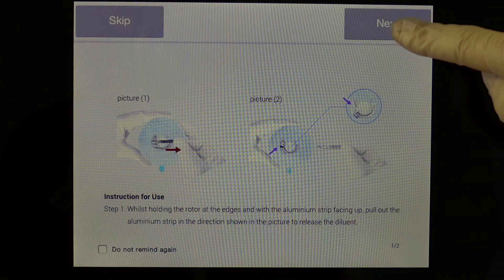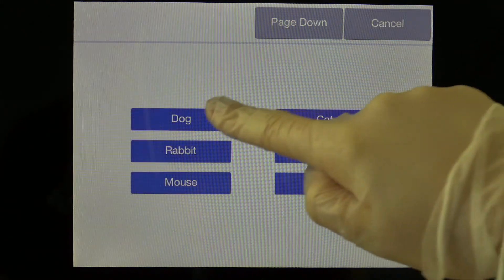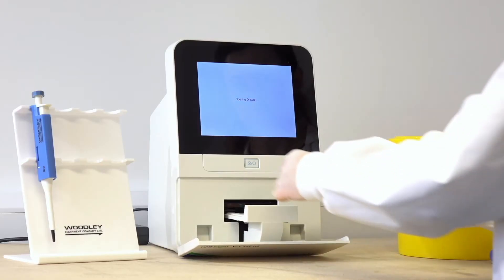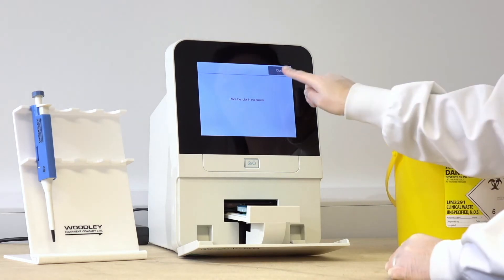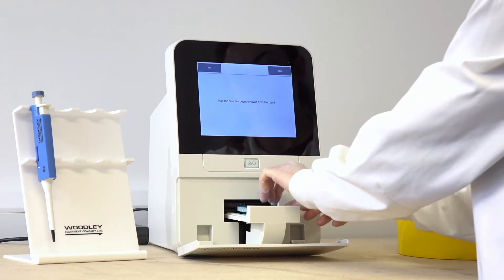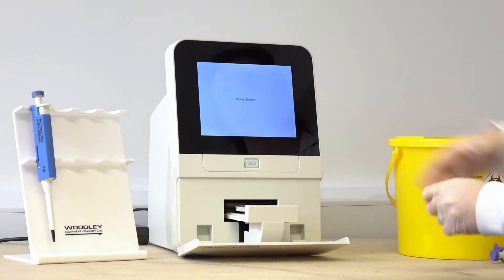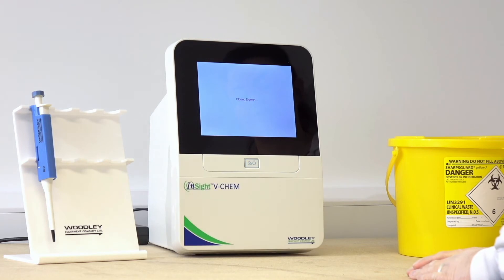The analyser shows on-screen step-by-step instructions on how to prepare the rotor for testing. Select the species to be tested on the analyser screen. Once the drawer has opened, place the rotor on the drawer securely and press Close. Ensure the blue film has been removed from the rotor. Analysis will now begin. Analysis time for whole blood samples is 8 minutes and 7 minutes for serum or plasma.